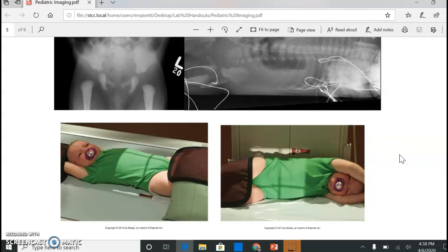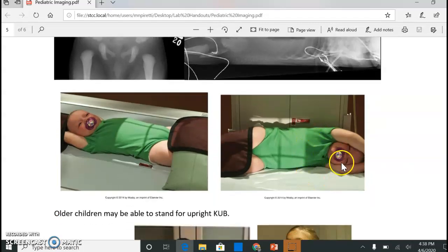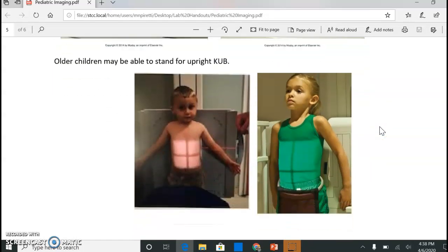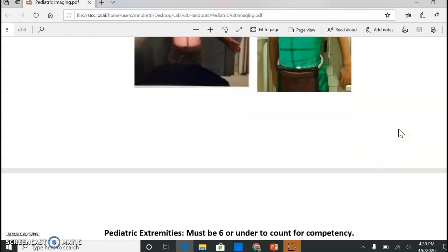For the left lateral decubitus abdomen, the central ray — you still want to go a little bit above the crest; they look a little low here, getting way down on the femurs. For older kids needing an upright, they may be able to stand right up against the wall stand. If they're a little wiggly, have the parent hold the shield on their pelvis, keeping them right up against that wall stand.